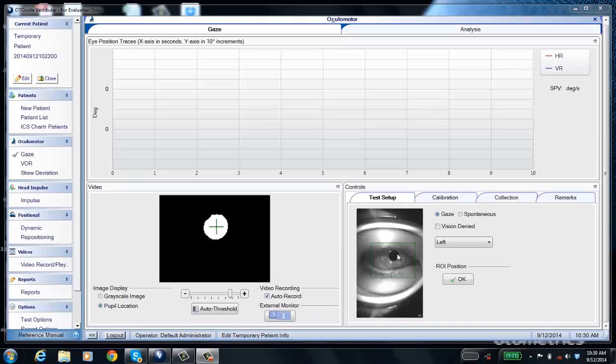Now I'm going to show you some data collected on a patient who has normal results. When the patient is looking downward, remind them to keep their eyes wide open, because sometimes the eyelashes cover the pupil a little bit — but if they open their eyes wide, that won't be an issue.